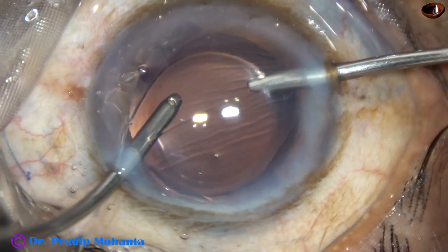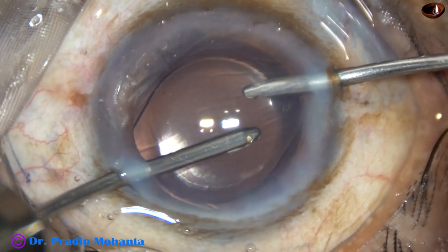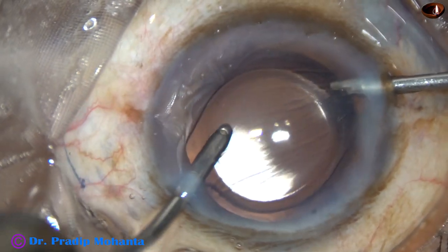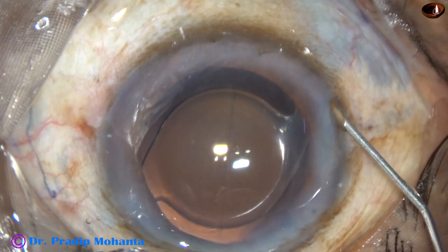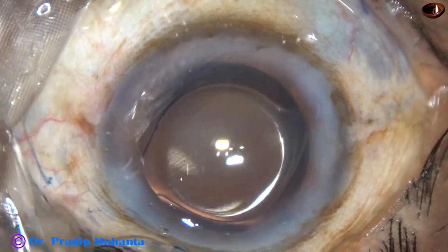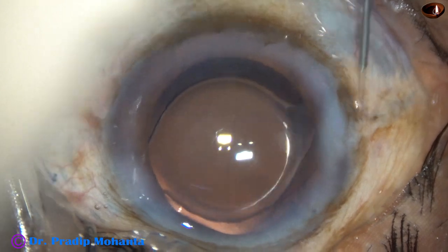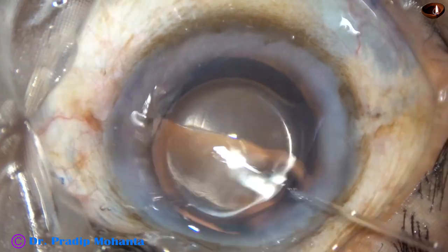Once the viscoelastic is nicely removed, clarity improves. You can see the faint red reflex. The optic of the intraocular lens is overlapped by the rhexis margin all around, so this is a nice rhexis. If we can do rhexis in this way, we don't need a femtolaser.